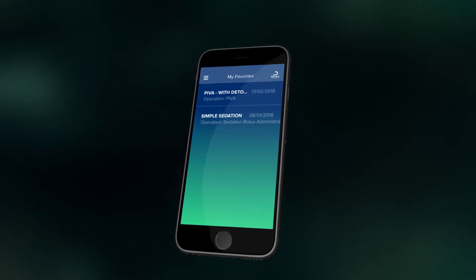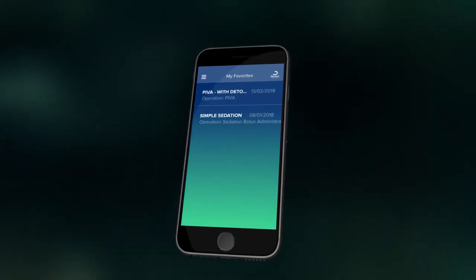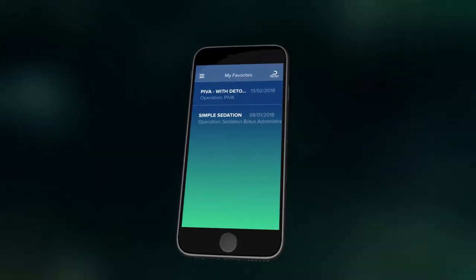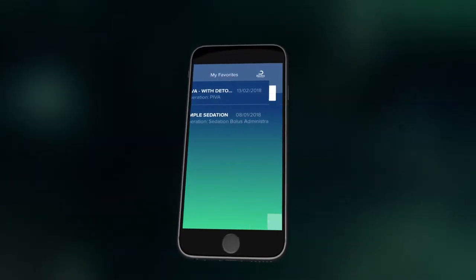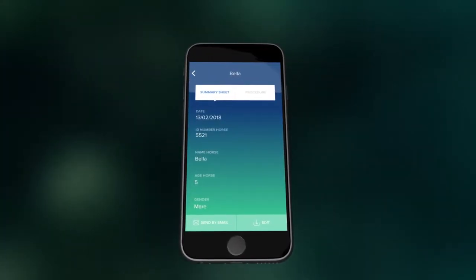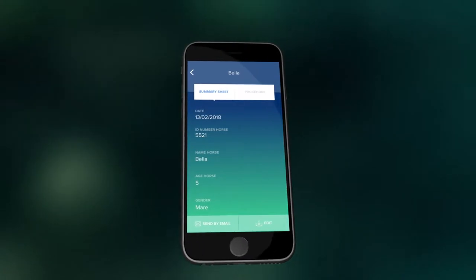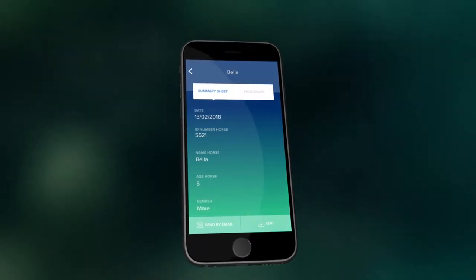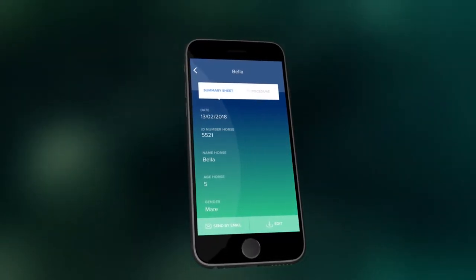You can save your favorite protocols within the app for easy use again. You can also send completed summary sheets of procedures via email to be included in the patient's records.